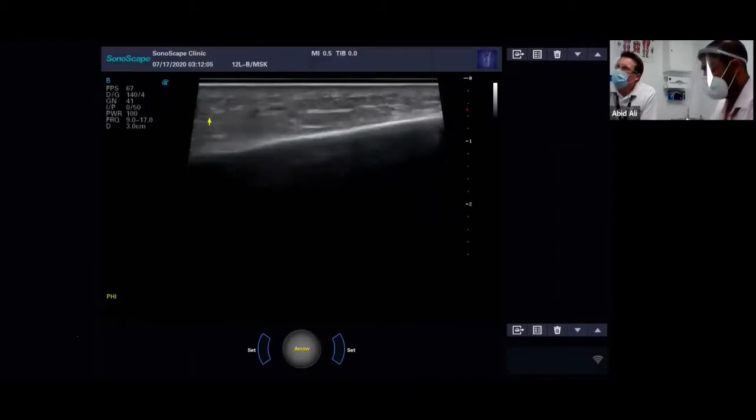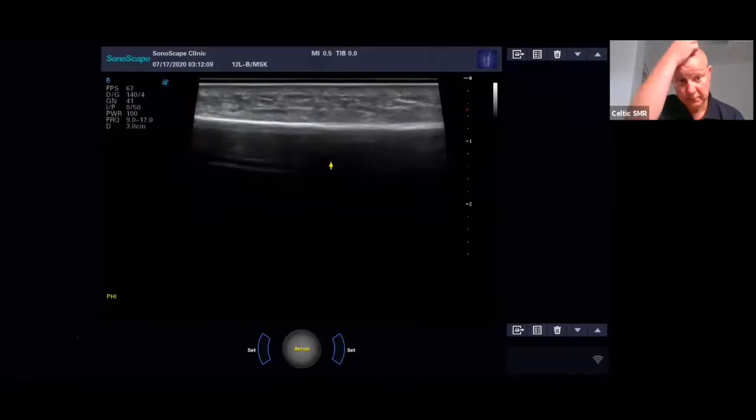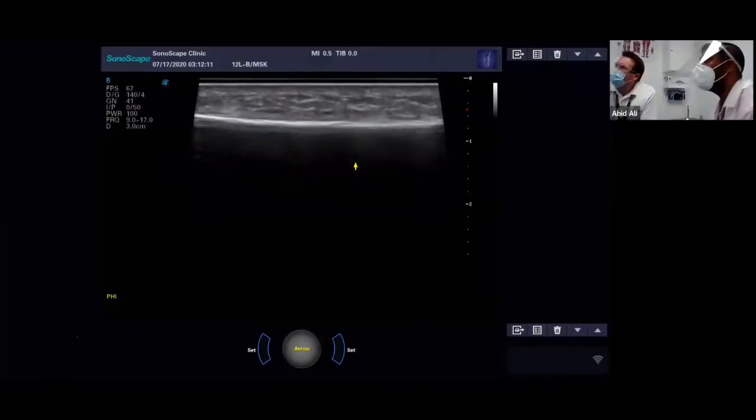Yeah, so we want to have it in the right plane of motion, back on the bone, making it nice and bright white. Okay, so got the focus up here, nice and superficial. And we've got the frequency set on the highest setting. 17. Thank you. And we're using a 9L probe? Yeah, so 12L probe, sorry.